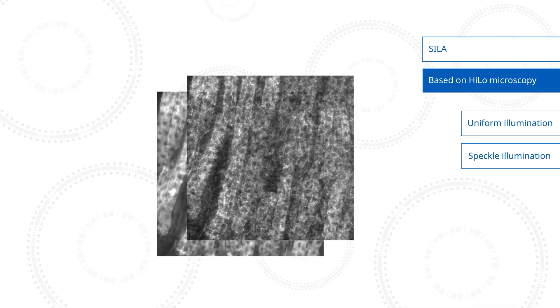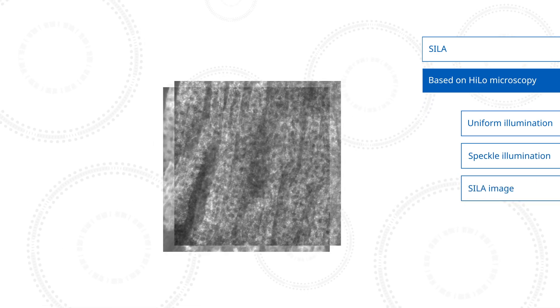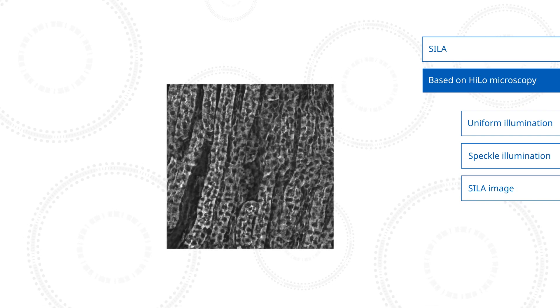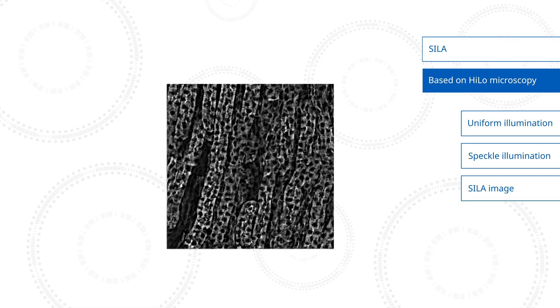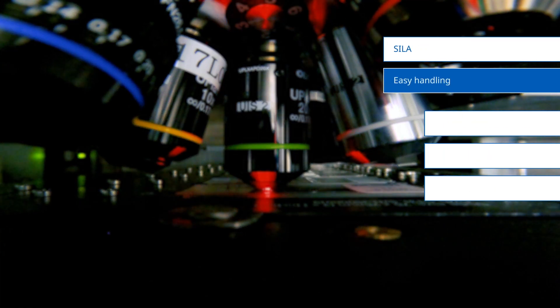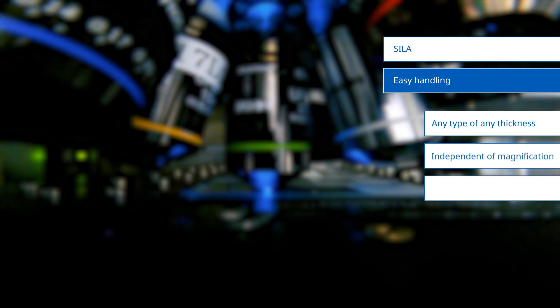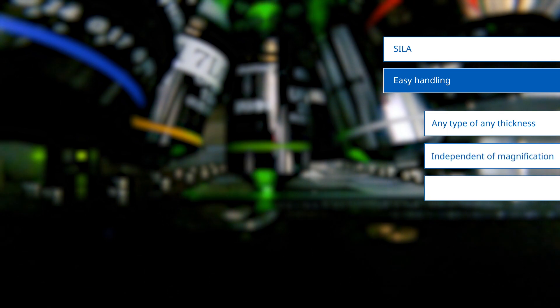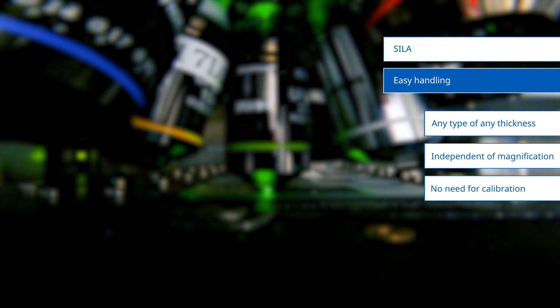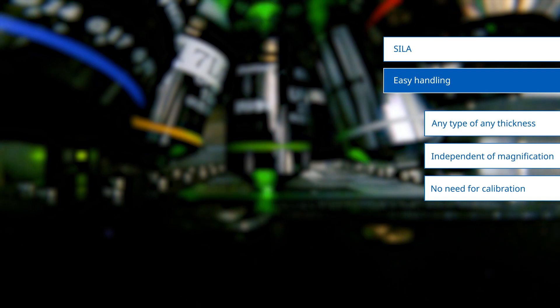They are mathematically processed to generate the final image. Working with the device is easy for samples of any thickness and independent of magnification. No calibration is needed.